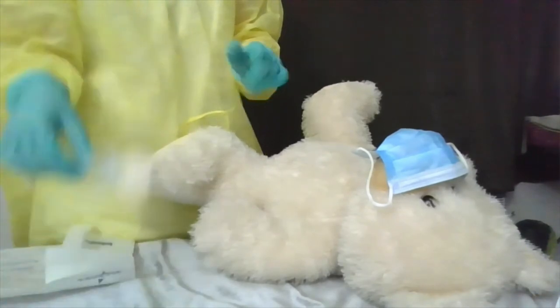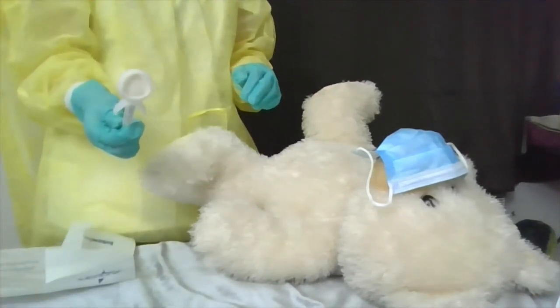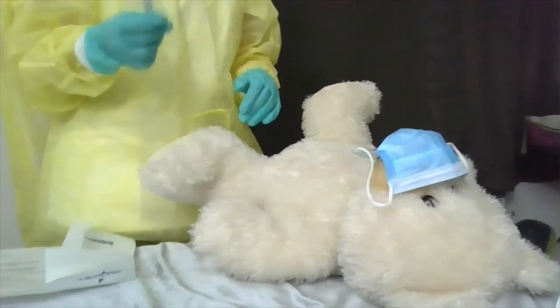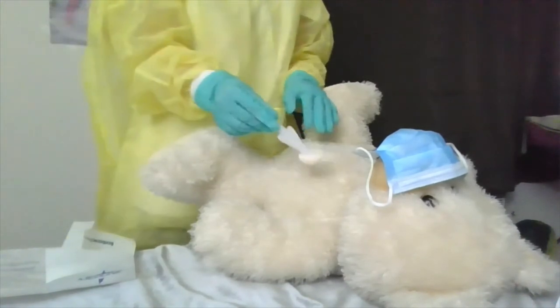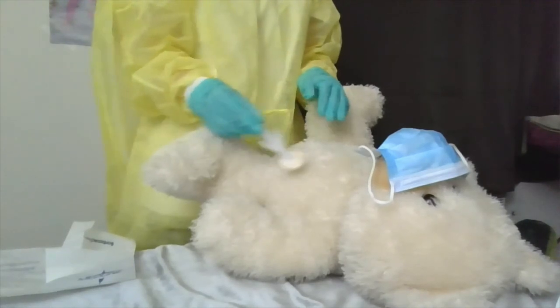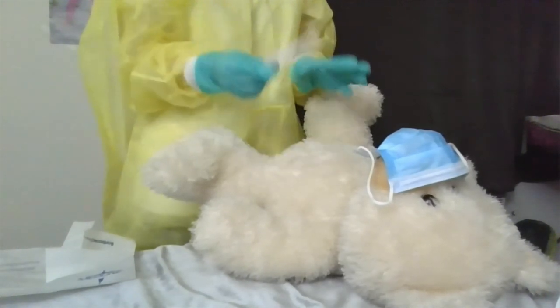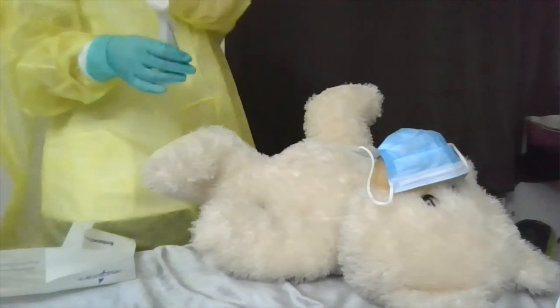Now I'm going to cleanse the site. I'm going to take my applicator and use 2% chlorhexidine and 70% alcohol. I'm going to go in a back and forth motion for 30 seconds as I clean the site. I've cleaned the site for about 30 seconds now.